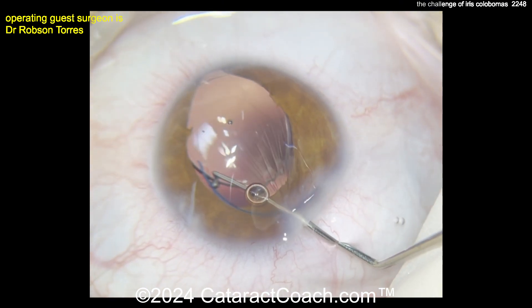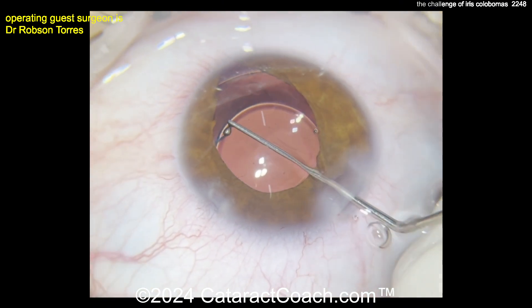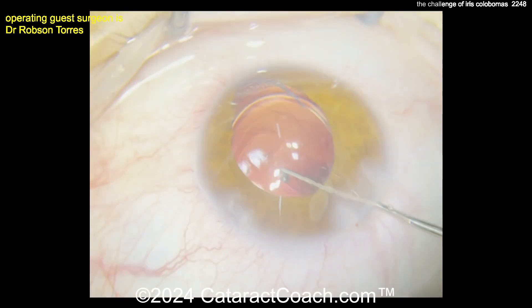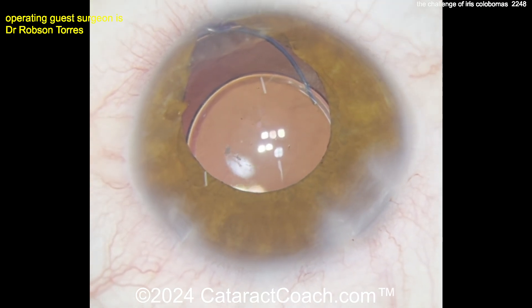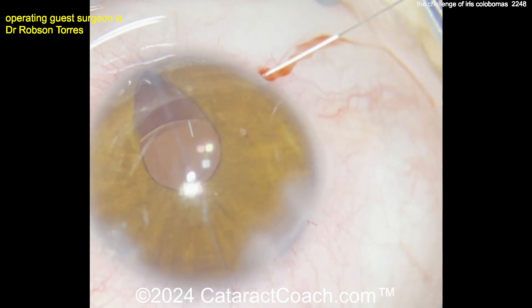Getting the lens dialed in nice and easy. With the IOL well seated in the capsule bag, it technically doesn't matter where you place the haptics because the CTR is already in the bag. However, in this case the surgeon is placing the haptics towards the area of zonular weakness. If you had a small area of zonular weakness and no CTR available, you could just orient the haptic there to act as a bolster.